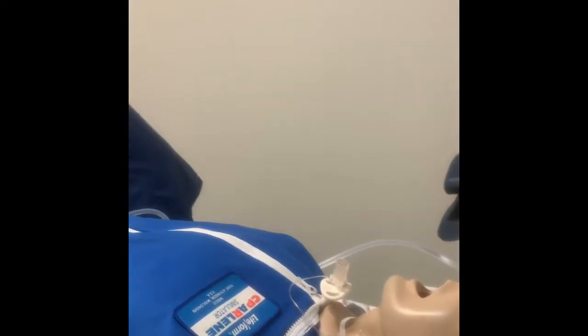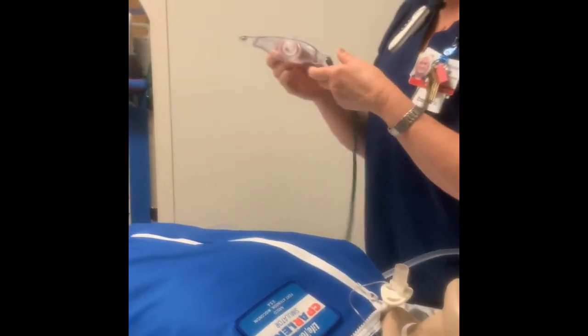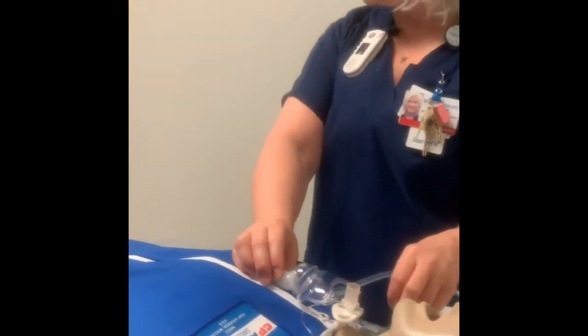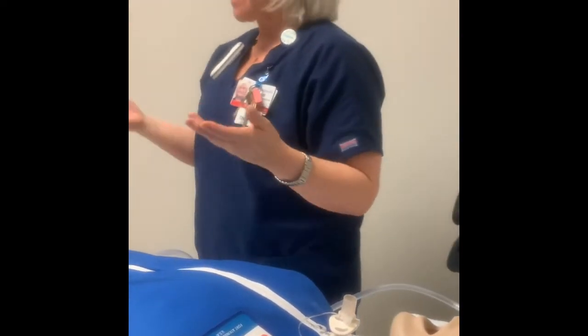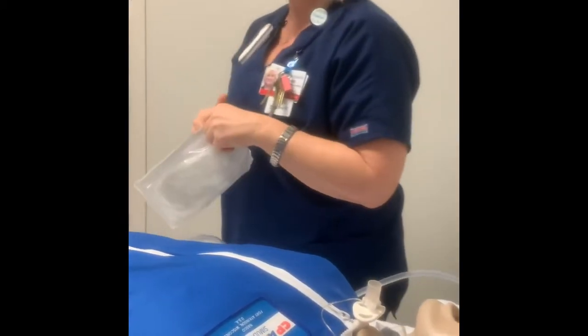So I always like to wear a face mask with a shield because if you take, say they have a trach collar on them, which I don't know, do you always use trach collars over here on your patients when they come out of procedures? Do you use any oxygen on them at all? They're okay. But let's say they're coughing and all of a sudden some little piece of sputum will pop out of there. It's happened before, getting your hair sometimes or something of that type. So I usually like to wear a mask with the shield up here to protect my eyes. But it's your call. You don't have to, but I like to do that, okay?